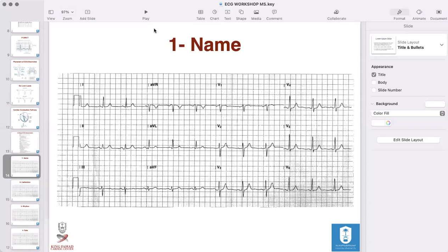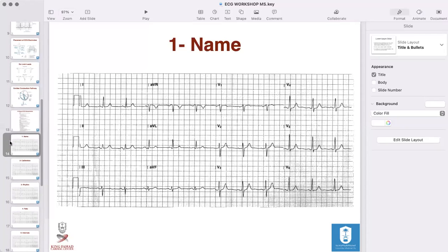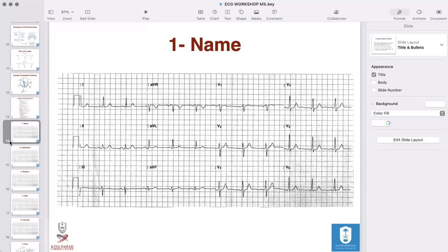And unfortunately, in practice now, we get called from the emergency department about cases because they're read as acute myocardial infarction on the computer analysis, which a lot of the time is not accurate, to be honest, because of artifacts or misinterpretation of the ECG. That's why someone has to read it and reconfirm that.